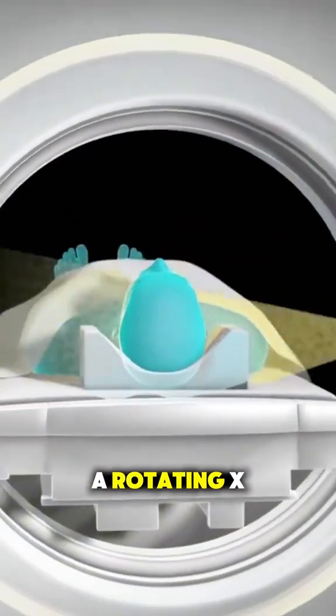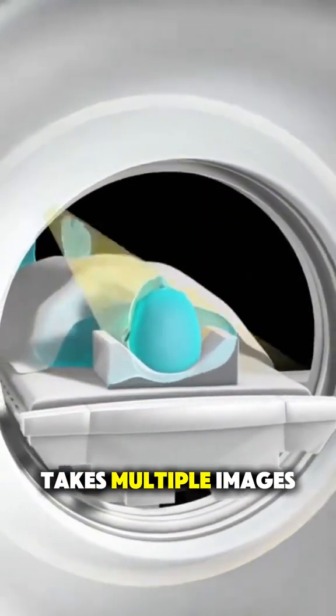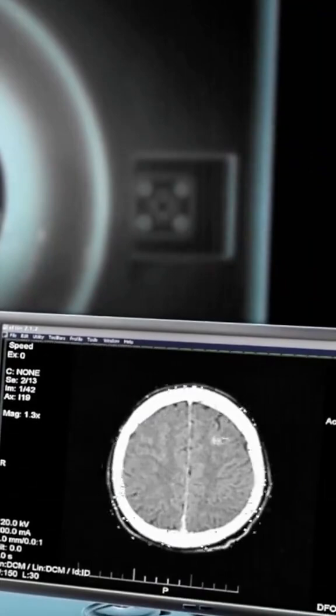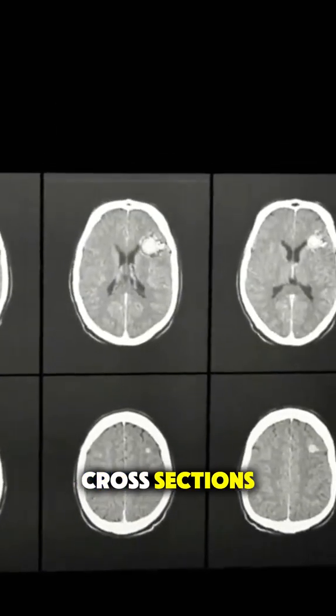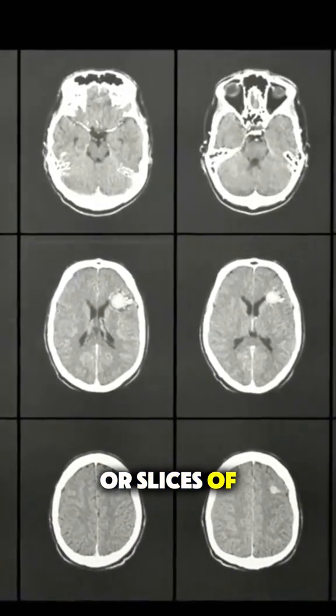Inside the machine, a rotating X-ray beam takes multiple images from different angles. These images are then combined by a computer to create detailed cross-sections, or slices, of your body.